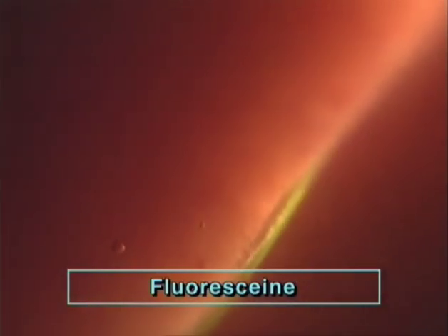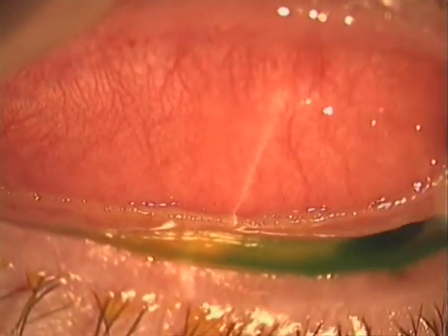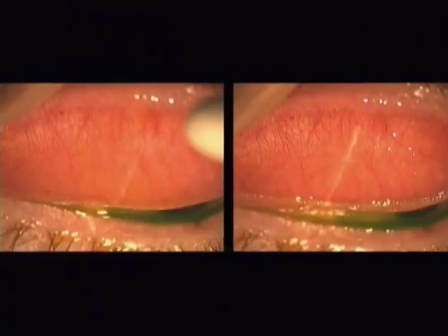However, closer scrutiny can reveal fibers in the fibrin-containing layer in indirect lateral illumination, and the layer itself can be made out in optical section. By staining with fluorescein, the surface of the tear film can be defined, and this allows the clear distinction between the fibrinous layer and the surface of the fluid. When the layer is wiped with a cotton tip, the underlying tissue with its papillary pattern and the larger vessels appear more distinctly than before the removal of the layer.